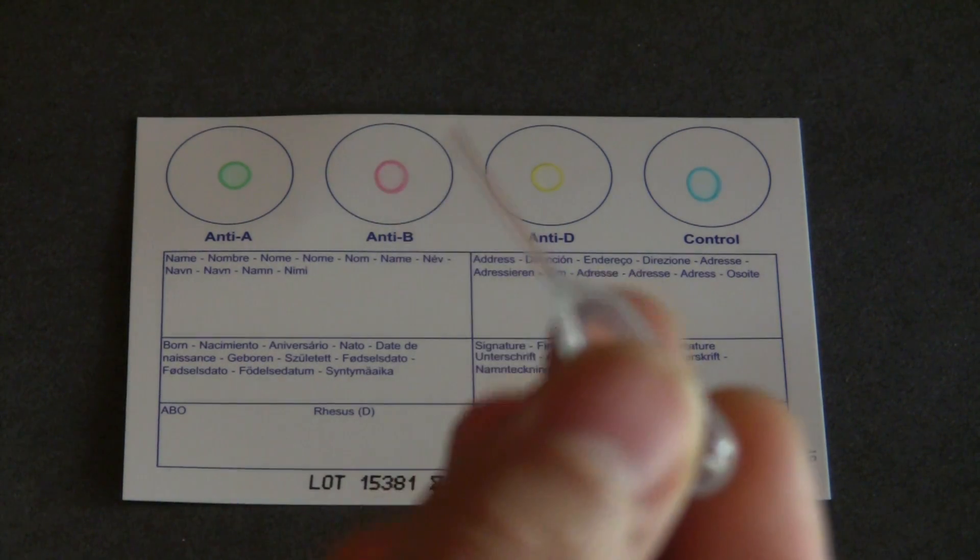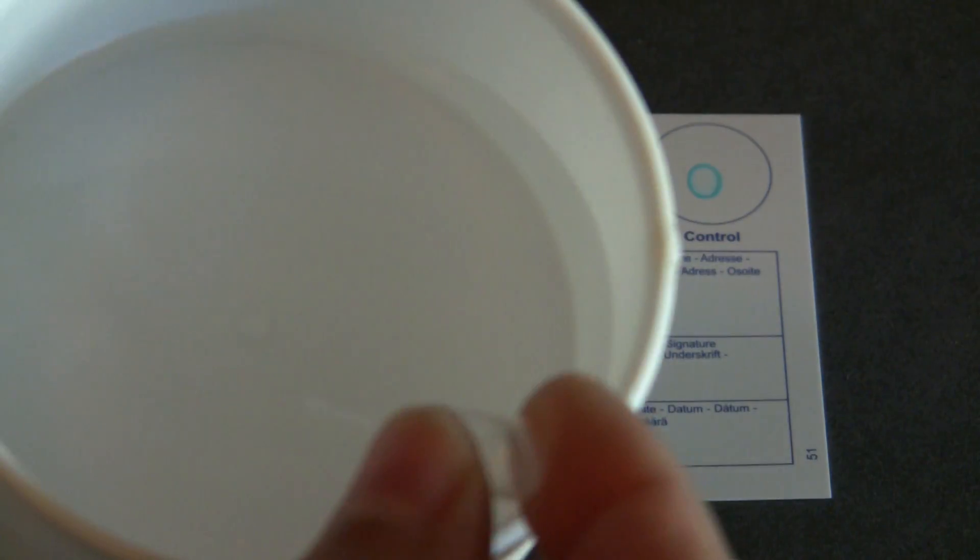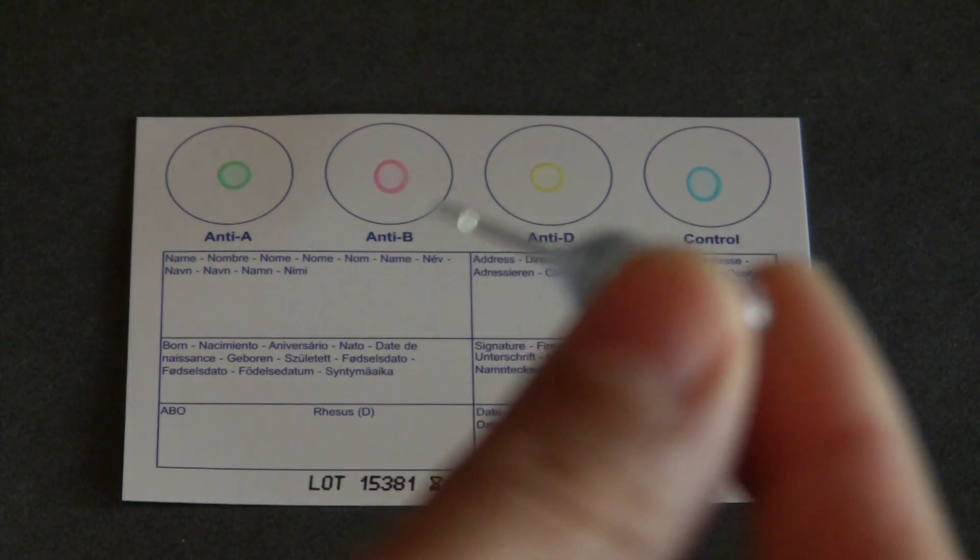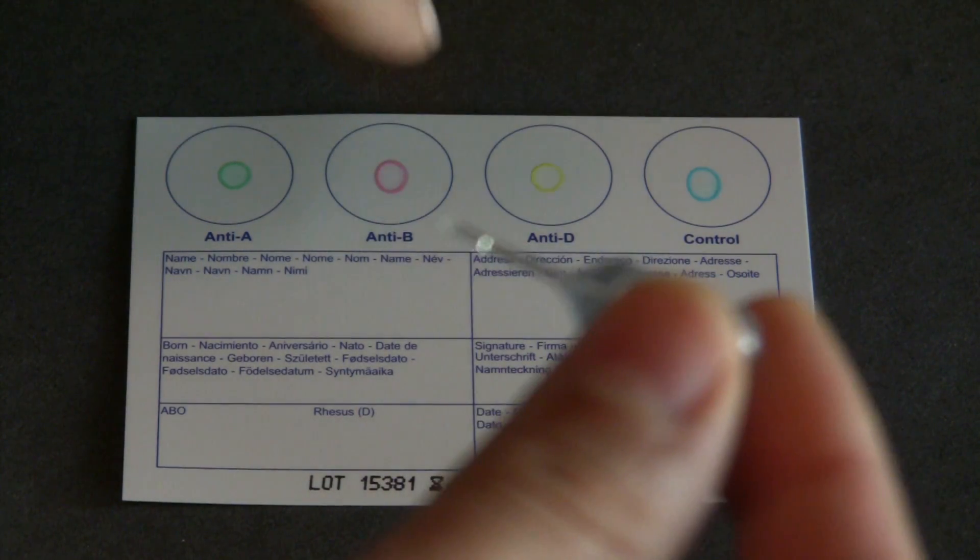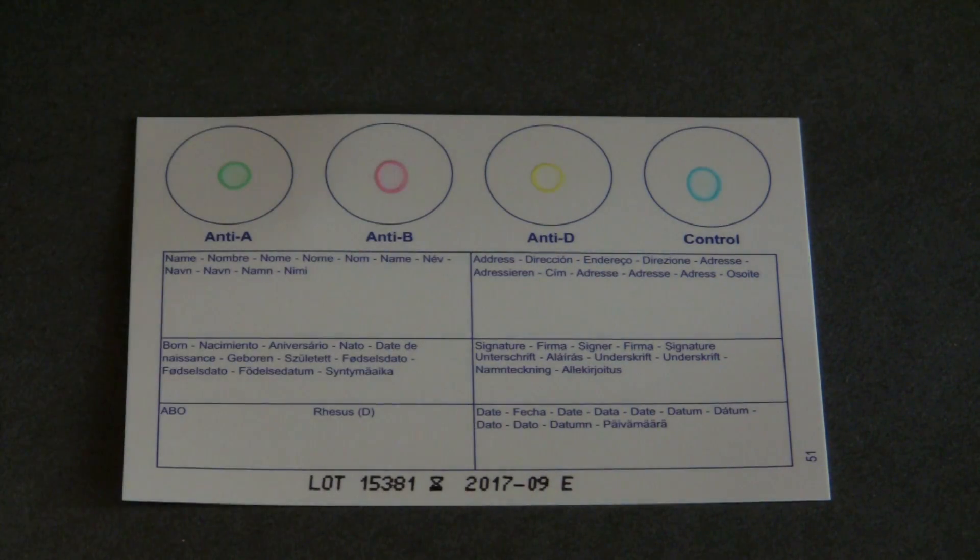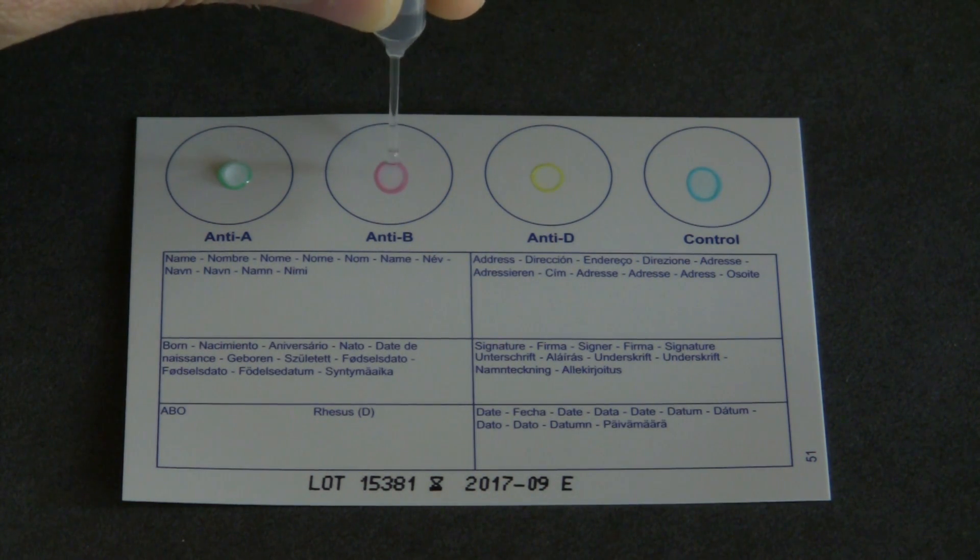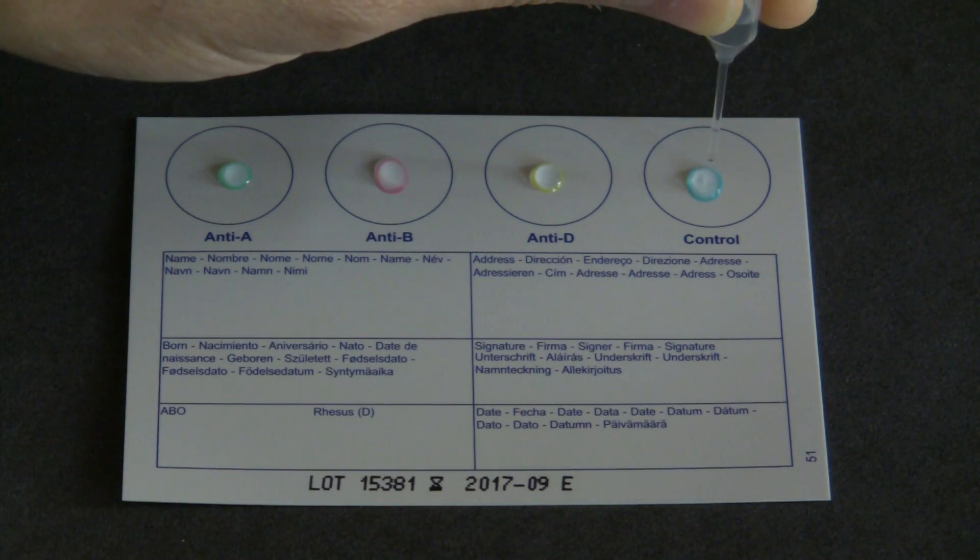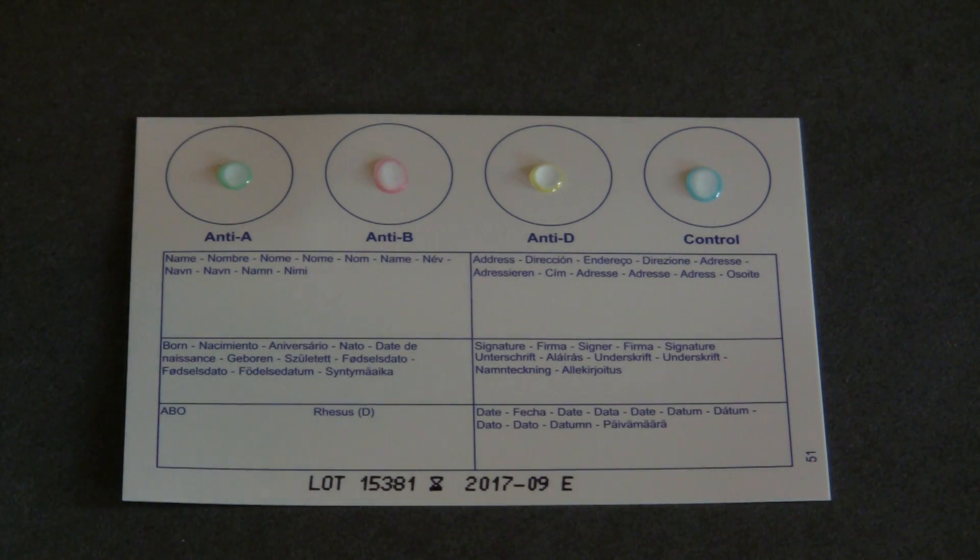All righty, so now we have the little dropper and I have a little small cup with water. I'm going to suck some water into the dropper and I'm going to put one drop onto each one of the blood type sections, making sure that I'm only putting one drop, one, two, three, and four. And one drop of water.